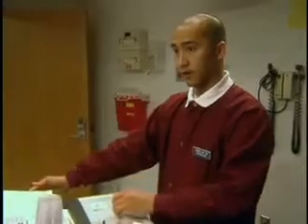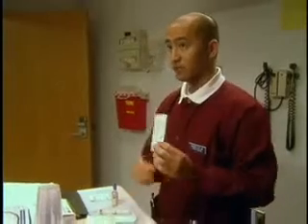Great. Then you'll want to prepare a label for the volume control administration set. Oh, the label's right here. It's already been prepared by the pharmacy.